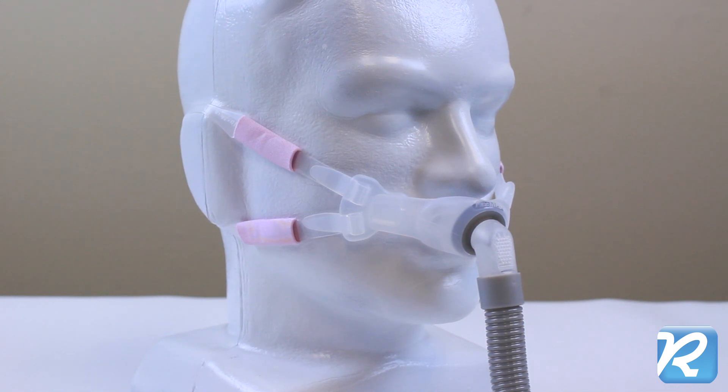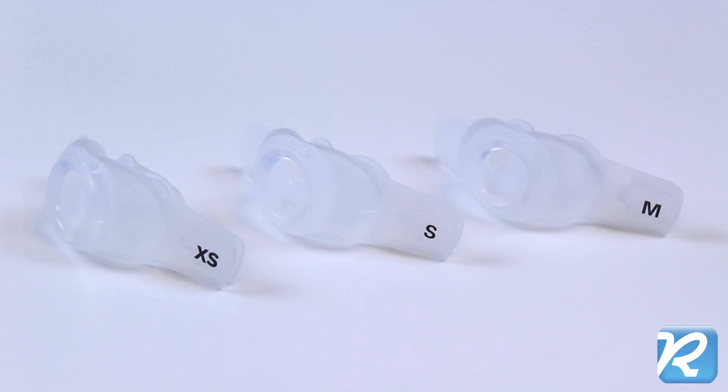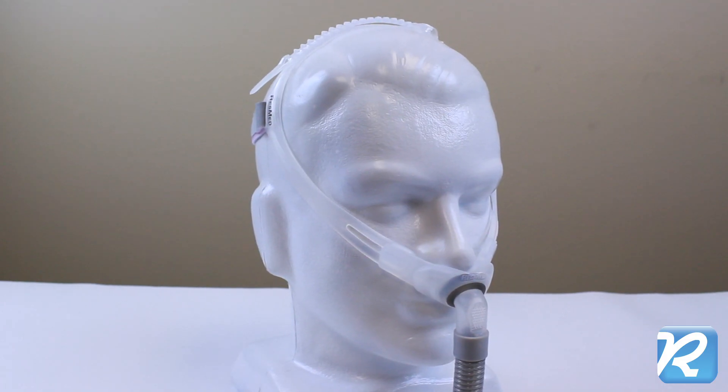The SwiftFX Bella, for her, comes with three sizes of pillows: extra small, small, and medium. Large pillows are sold separately.